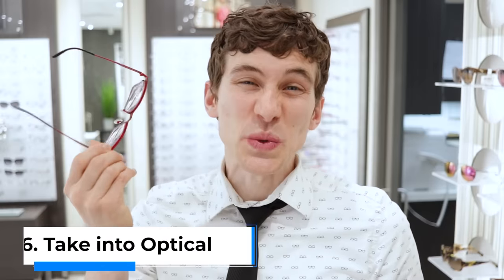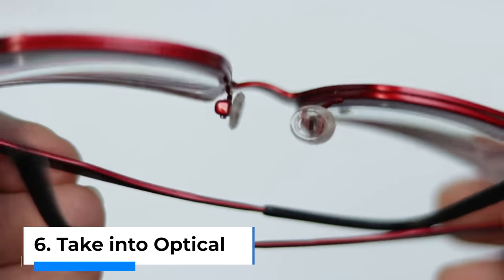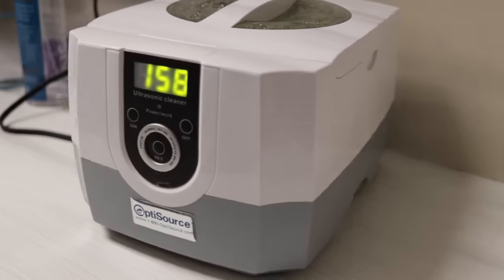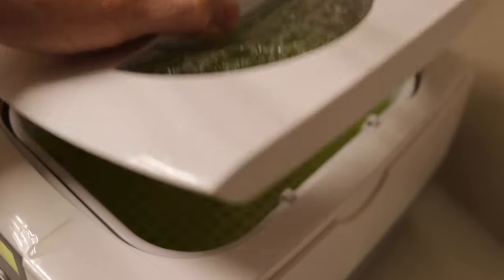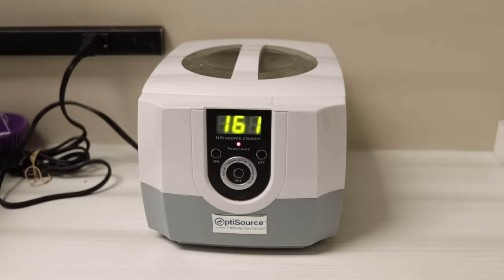Tip number six is that if your glasses are really dirty — gummed up around the hinges, the nose pads, and around the edges of the lenses — then just bring them in to a local optical or glasses shop. They often have special cleaning devices that will completely strip all of that debris off. Here at our clinic, we actually have an ultrasonic cleaner where we can pop out the lenses, throw them in the cleaner, turn it on, and after a few minutes it vibrates and shakes the lenses, removing all that debris from those hard-to-reach spaces. Pretty cool, right?